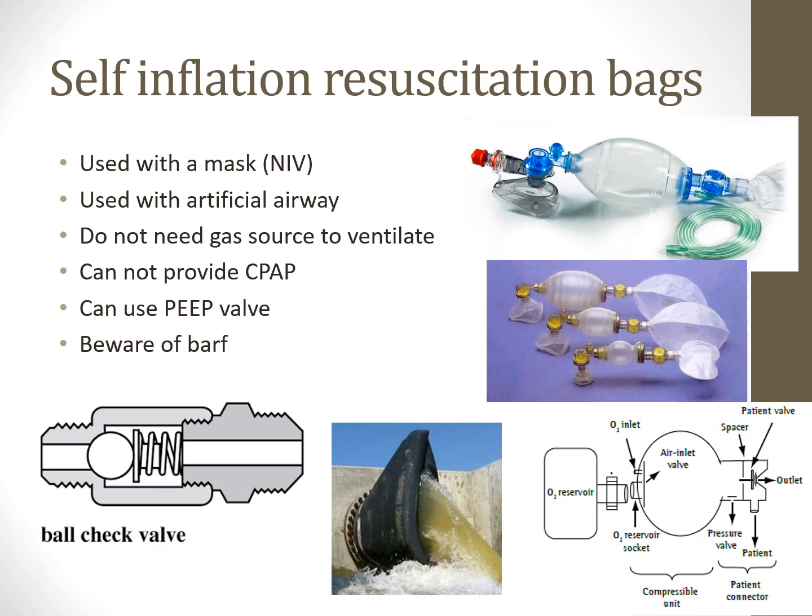Self-inflation bags are most common on adults. These are pretty universal. You'll see them in almost every emergency department too. These are used with a mask for non-invasive ventilation. Make sure you're using the right size mask. We can also use them with an artificial airway.